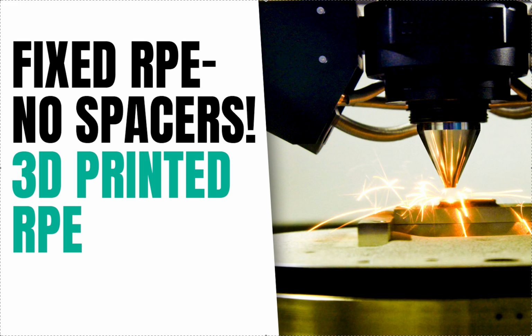Now these are metal printing RPEs, and I didn't even know there was such a thing as metal printing. Then I started taking a deep dive into it, and I realized that these metal printing machines are incredibly expensive. I saw that they were somewhere between 150 to 200,000 for machines. So this is not something you're gonna have in your dental office. This is definitely something only a high-end lab is gonna have, and there's a pretty expensive price point. So, metal 3D printing.